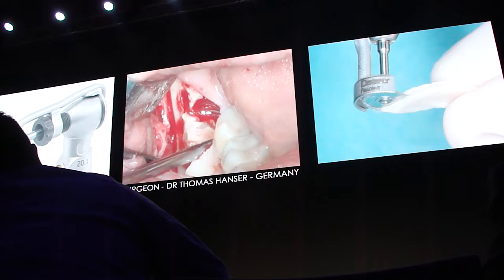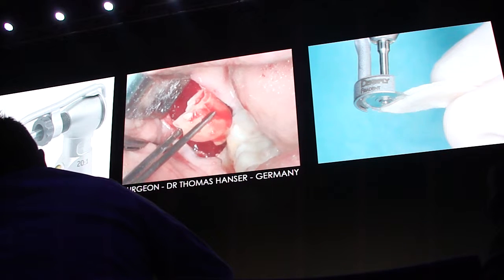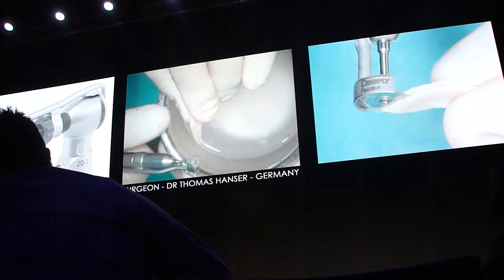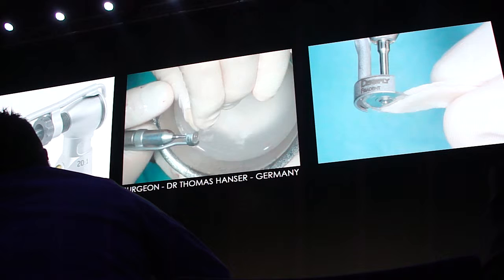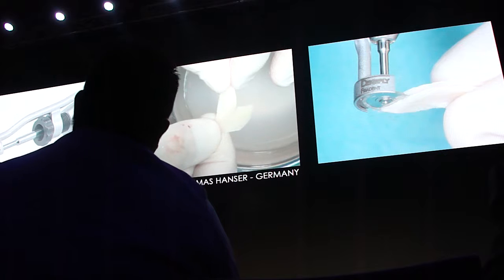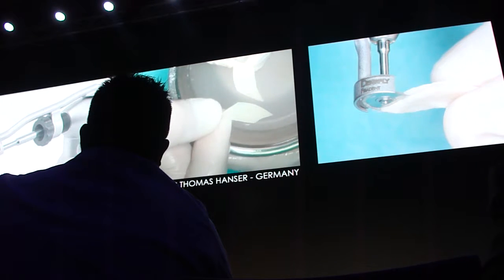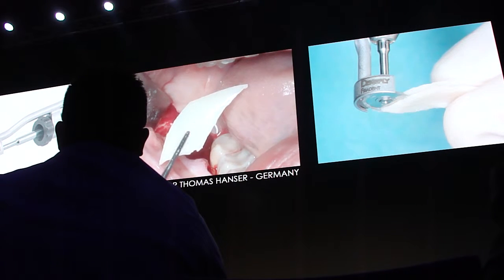So very often we are able to combine those procedures with the grafting procedures. The beautiful option with a microsaw is in fact the very thin disc, so we can very precisely cut the bone. We can even split this bone block into two thin bone membranes, coming finally to the stage of this biological concept of using thin bone blocks in combination with bone chips. So the instrument doesn't only allow us to very precisely and safely harvest bone, but also to extremely precisely cut the osteotomies.